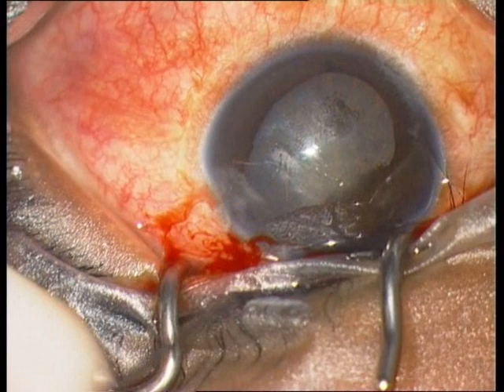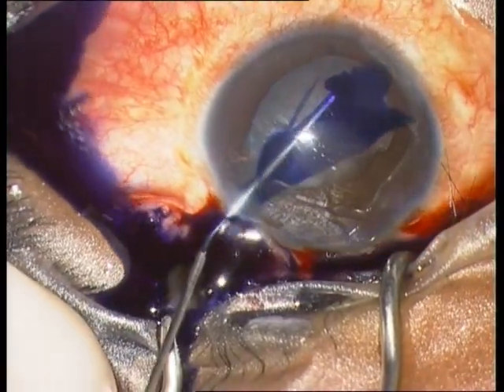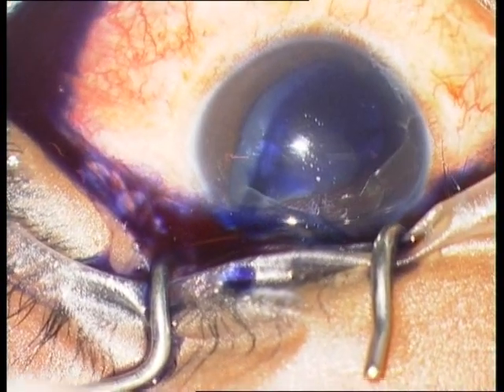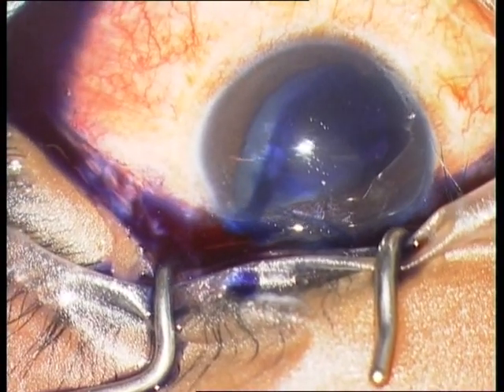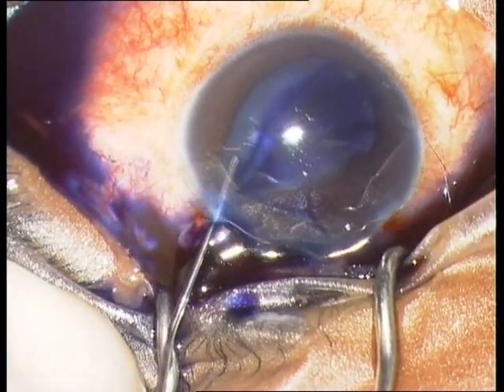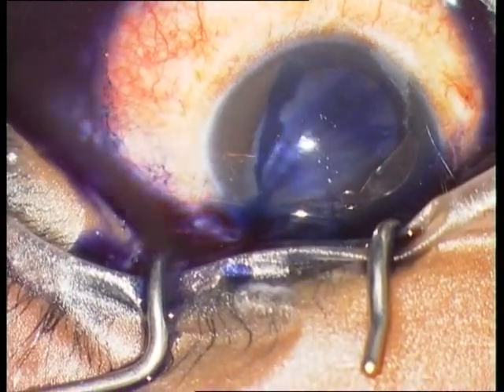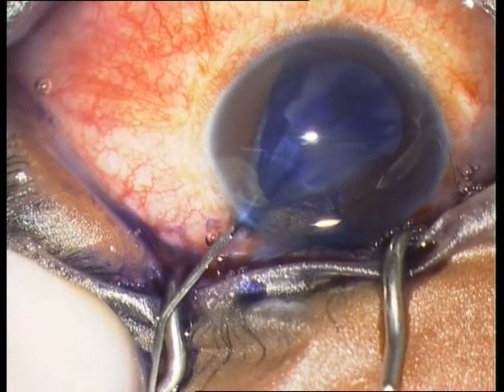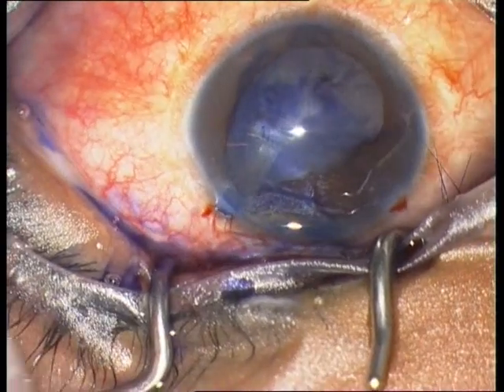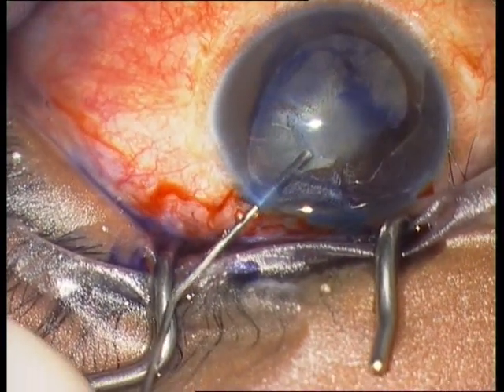I therefore inject viscoelastics first, and then behind the viscoelastics, vision blue. It is no problem to use vision blue with viscoelastics. Then remove the vision blue with BSS and add some viscoelastics to inflate the anterior chamber again.